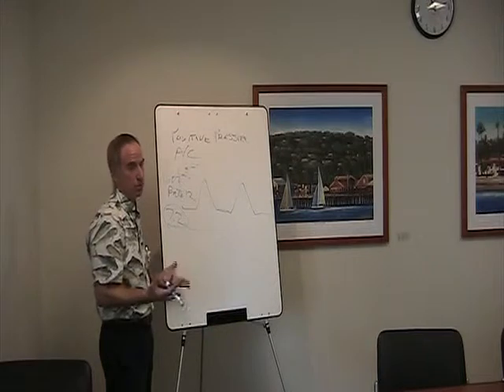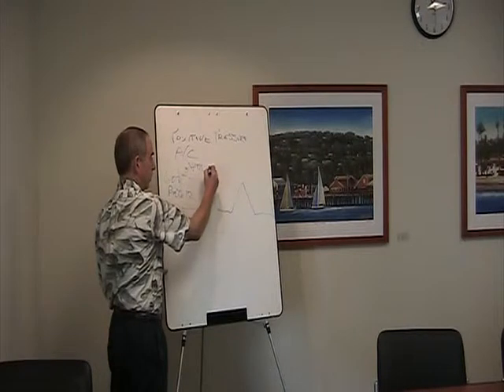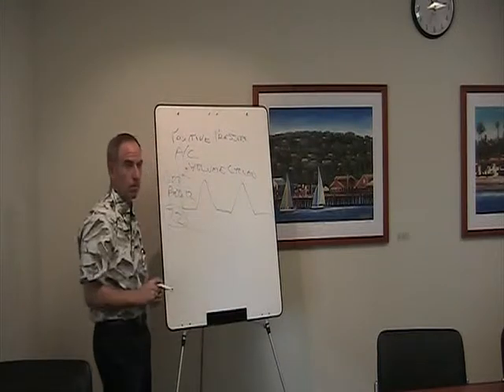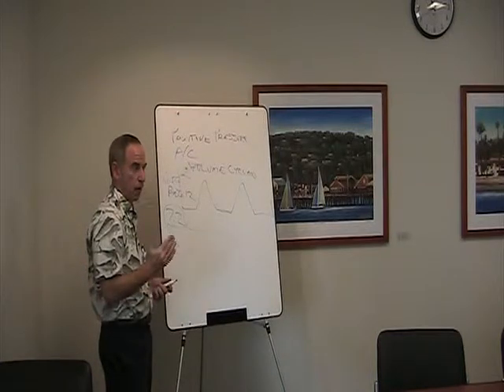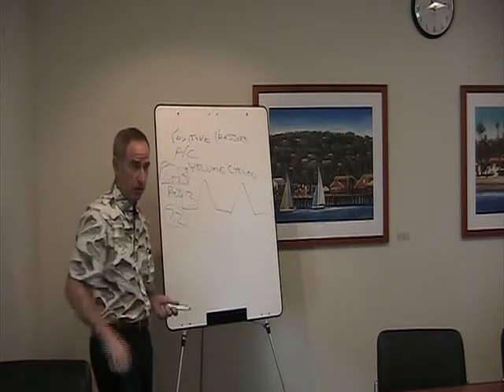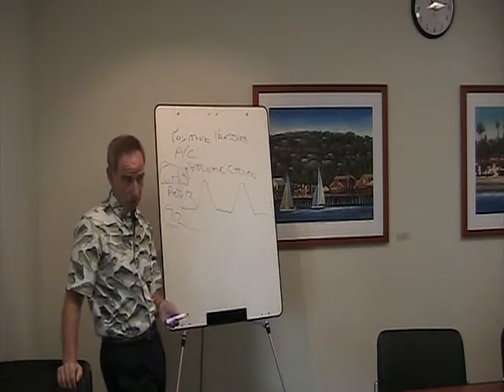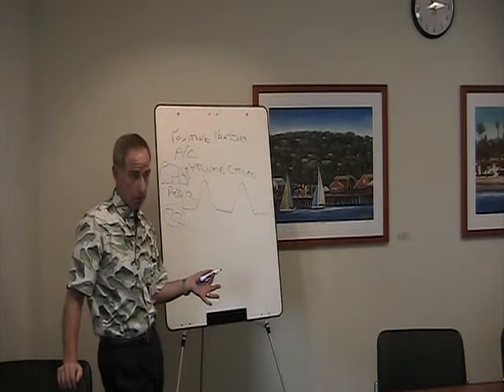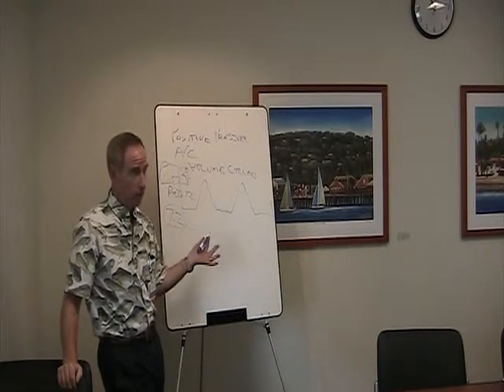So what are the problems with this mode of ventilation? With this volume cycle, now we have volume cycle. Well, as that volume, then you can have pretty high pressures. Okay, so if you're cycling volume and you're absolutely giving 600 cc's of volume, and you have a change in your resistance, say the resistance goes up, okay? You have secretions in your airway, or you have atelectasis, or you have mucus plugs.